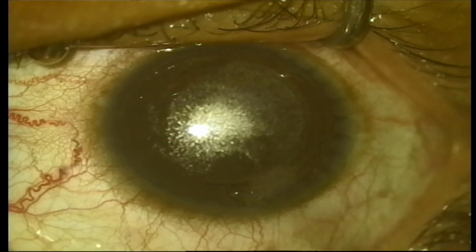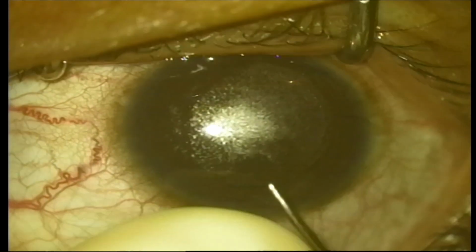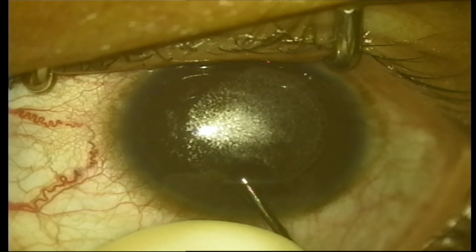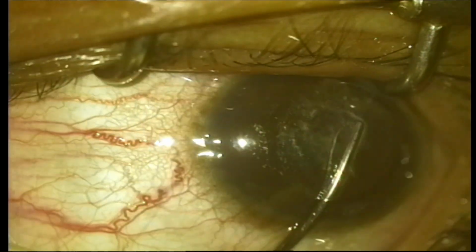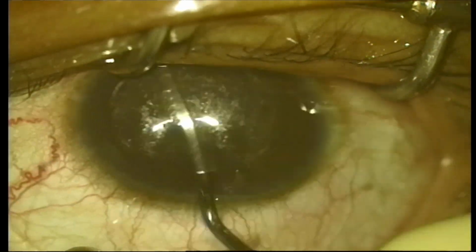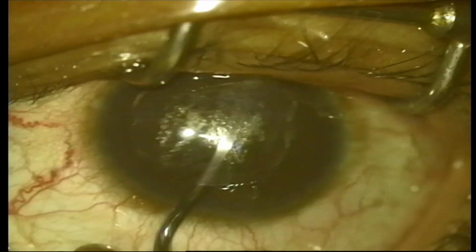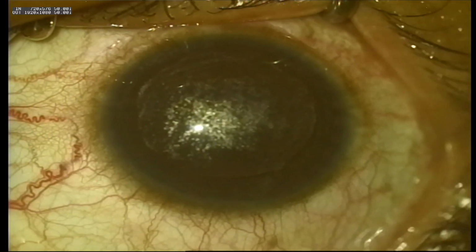Okay, and then there is, look straight. And then there is a drop, and that was described by you people, and then Tityal and all. And then you will also have a white ring sign. Look straight up. So we are going into the anterior of the lenticule. It doesn't matter, you can go anywhere, but when you are going into the posterior of the lenticule, you need a better light. Look into the light.